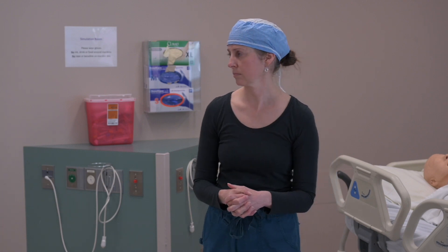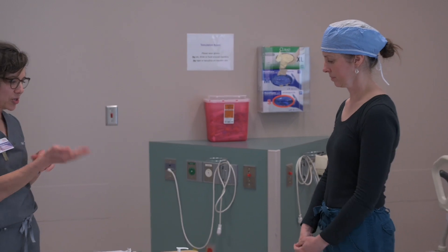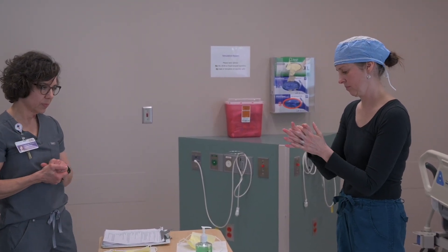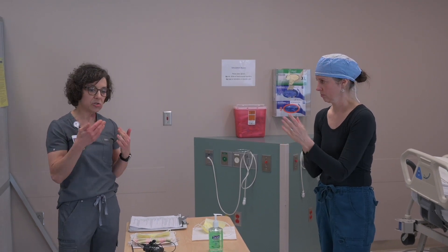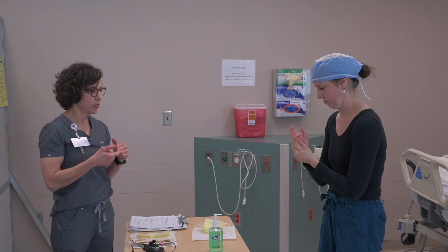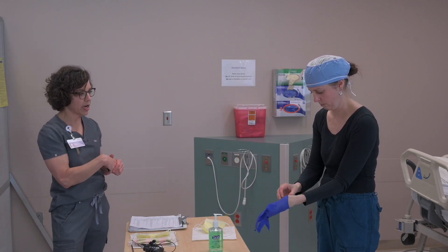Without further ado, we'll go ahead and don and doff, and when we're done with that demonstration I'll be happy to take questions. I'm just going to talk Brooke through the process just like we do every day at work. We do use two pairs of gloves in our PPE ensemble, which provides for a safe doffing process — I'll explain the rationale when we get to that step.